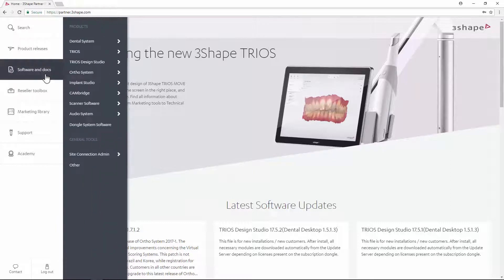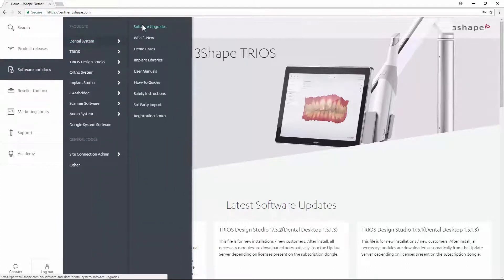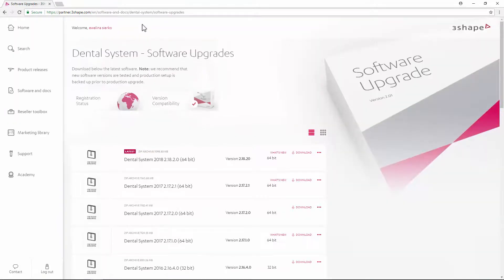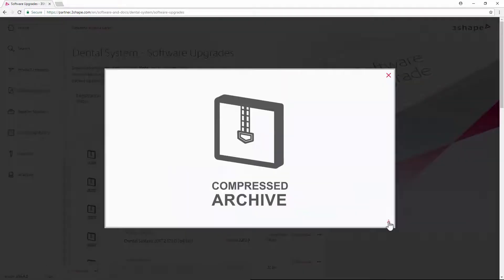Start with downloading the 3Shape Dental System installer from the partner portal. You can also download the installer prior and have it on a USB stick.